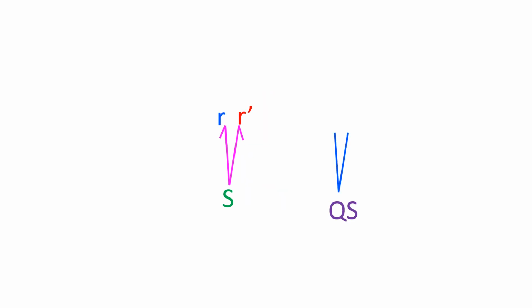Waves of lower amplitude are denoted by lowercase letters and larger amplitude waves by uppercase letters. Example, RSR prime means a small R wave followed by a deep S wave and a secondary R prime wave. If there is only a single deep negative deflection, it is called a QS complex.